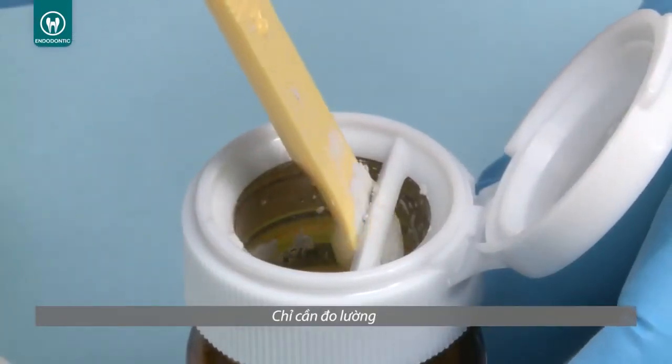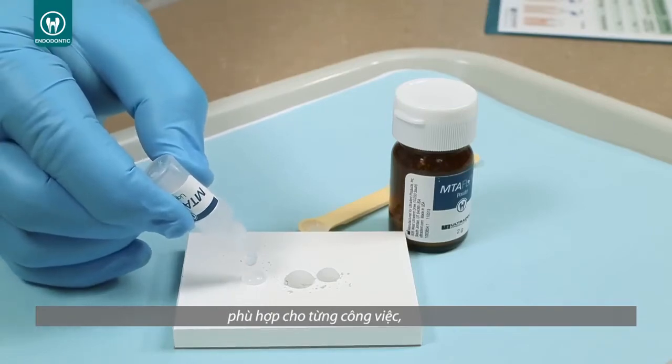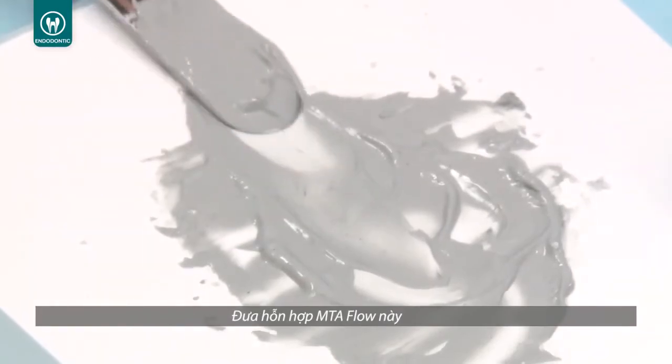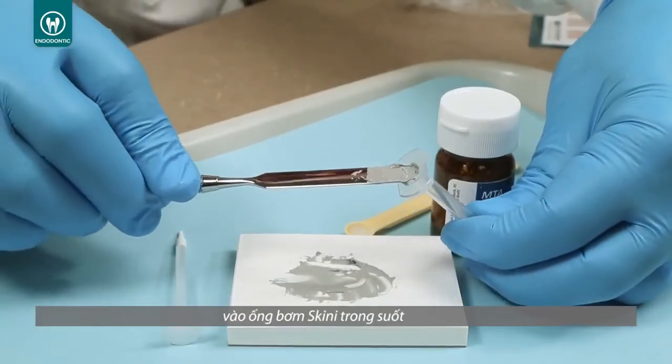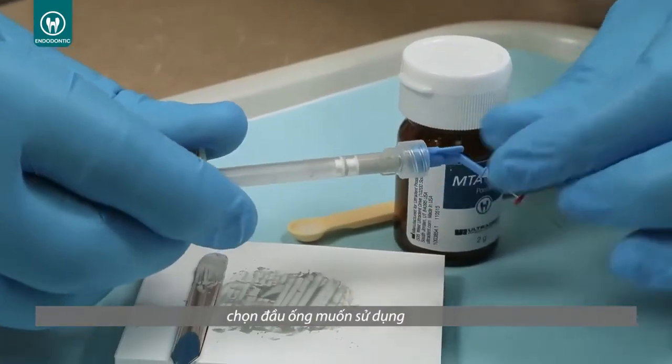Using MTA Flow is easy. Simply measure the appropriate amount of MTA powder and gel needed depending on the procedure. Mix to a smooth consistency, insert the mixed MTA Flow into the back of the skinny syringe, reinsert the plunger, and choose the desired tip needed.